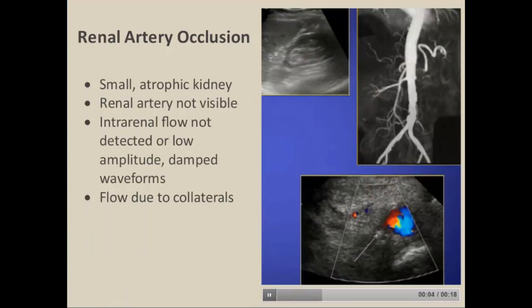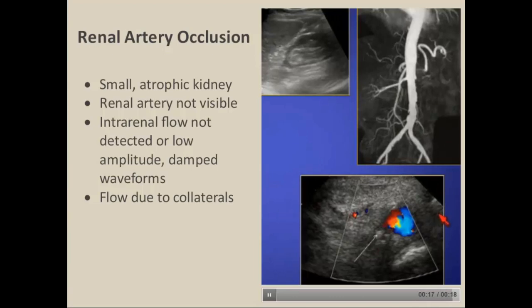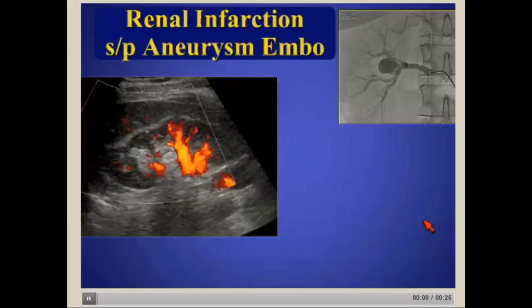For renal artery occlusion, if it's chronic you'll have a small atrophic kidney. The renal artery will not be visible on your color display, and you may see some intrarenal flow related to collaterals — that intrarenal flow will be very damped.